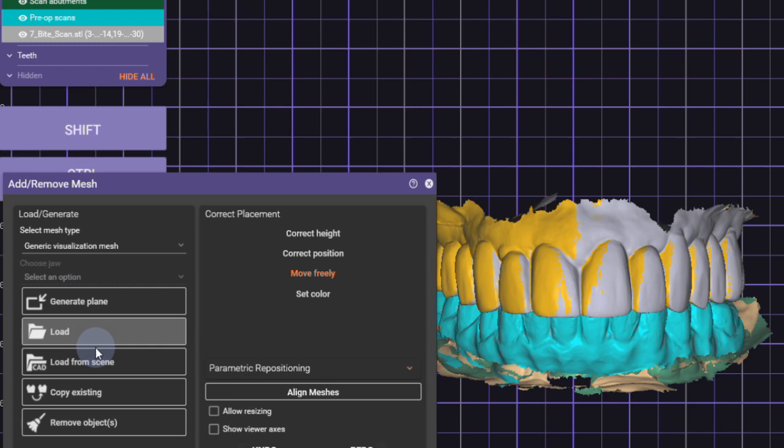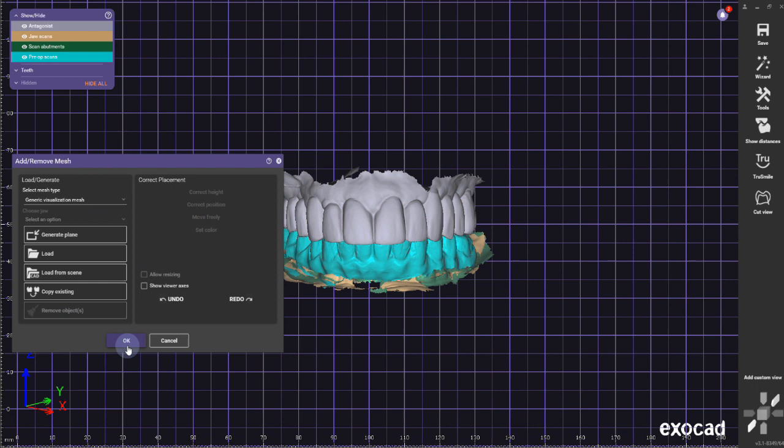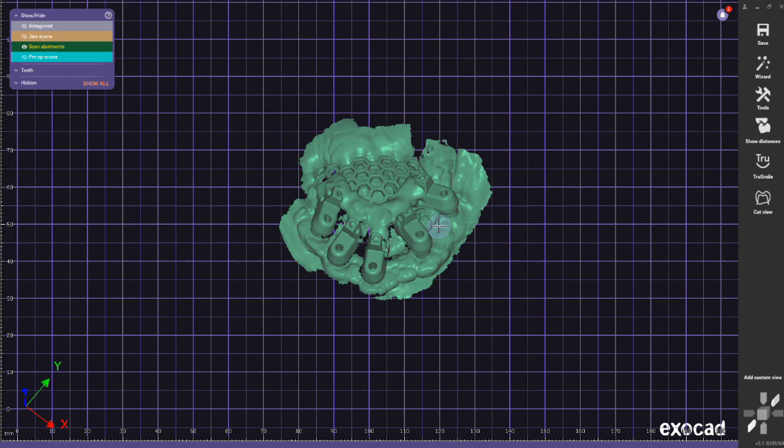And what you don't need anymore—you don't need the bite scan anymore—so what you can do is you can go to remove the mesh. This was a generic mesh, so I'm going to remove it, click OK, and then it's gone. And that helps with the database, it helps with the data so the file doesn't get so full.